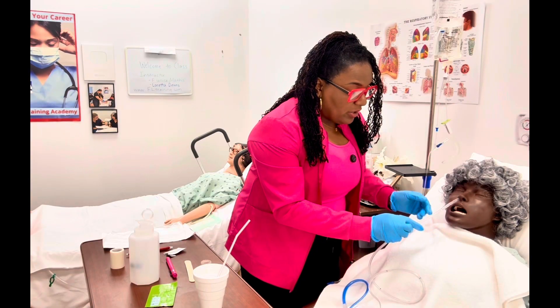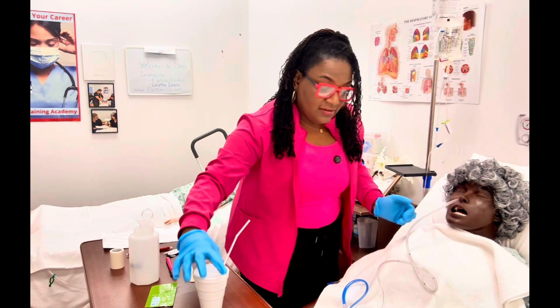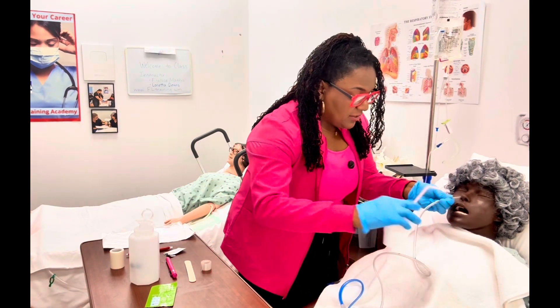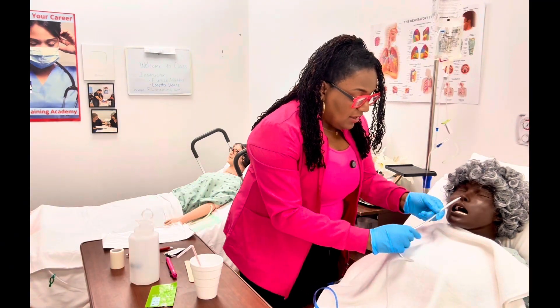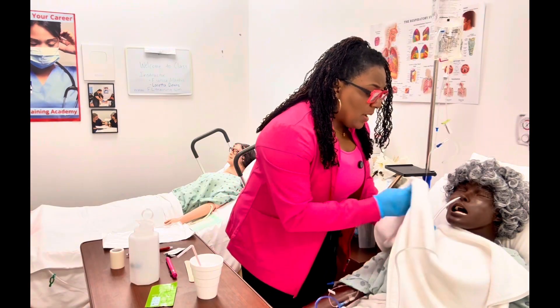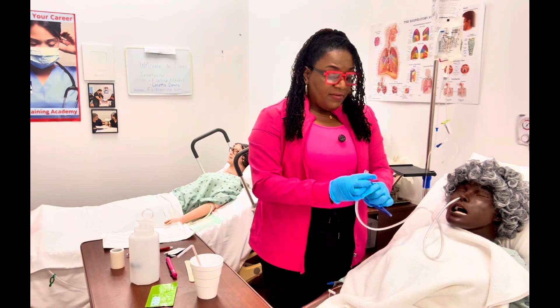I'm going to follow the direction of the nare. On three — one, two, three. Hold your head down for me. Now let's get you to drink something — take a sip, take a sip, take a sip. All right, it is in there. How do you feel? Are you okay? Let me wipe some of that lubricant from around your nose. You did really well.